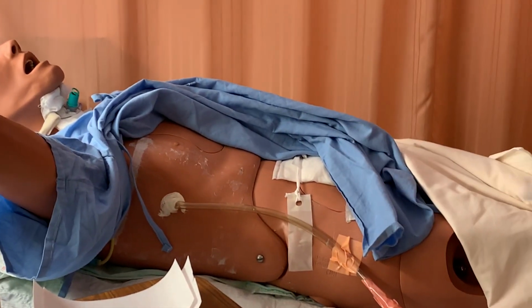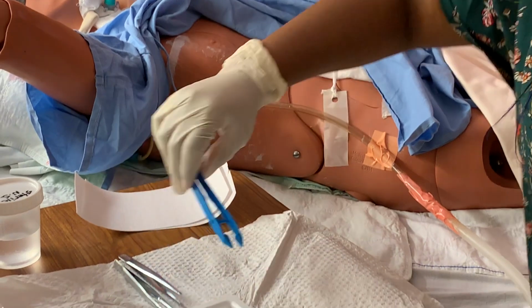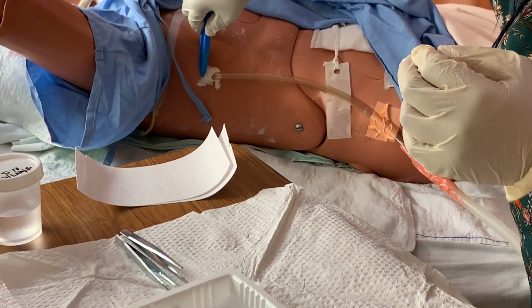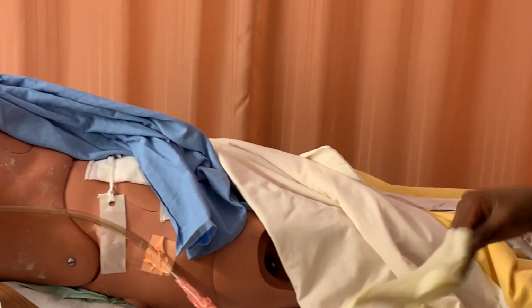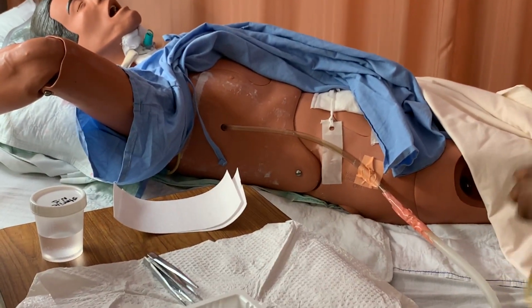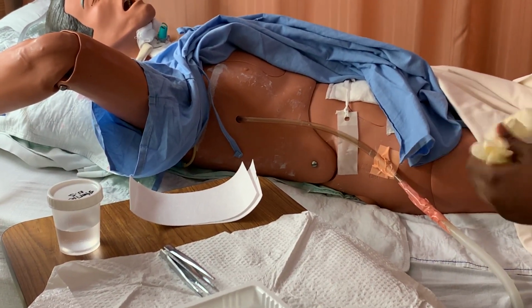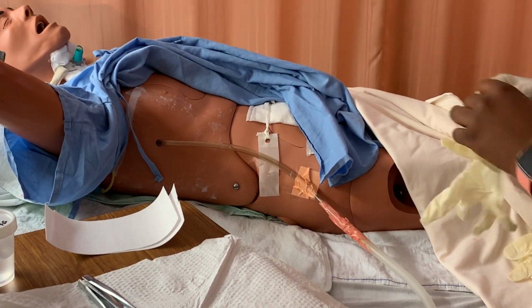I'm gonna check that there's no damage on this. Also I'm gonna take out my Jelonet, and I'm gonna get rid of that as well. I'm gonna get rid of my gloves. Looking at the site, there's no redness, there's no edema, there's no signs of infection. Patient doesn't have any complaints of irritation.